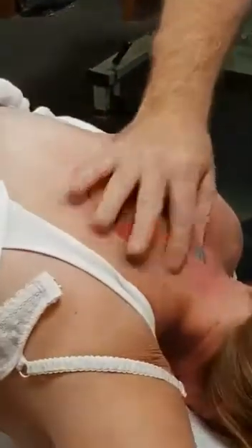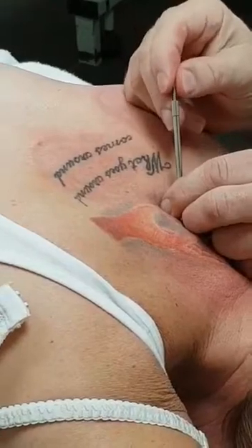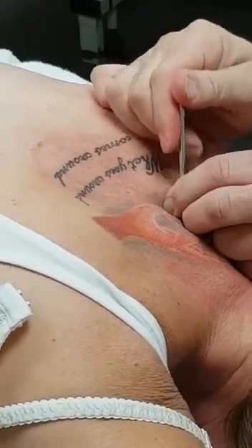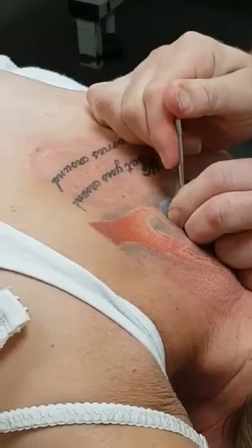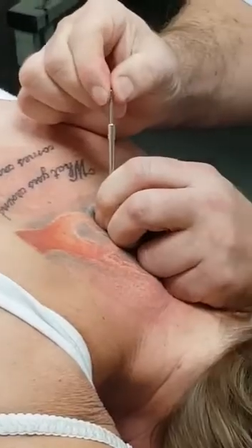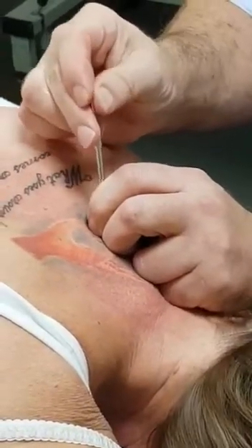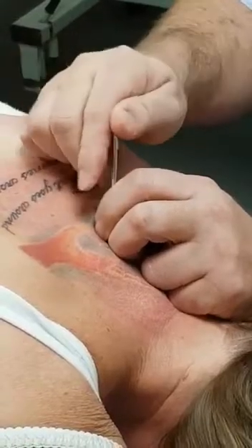There's a point on that right side, but we're going to do it on the left to start with. Very thick — can you feel it? Yeah. You can see it as well. And then what we do is move around, and then suddenly boom, it gives. And it's free to go. Wow.